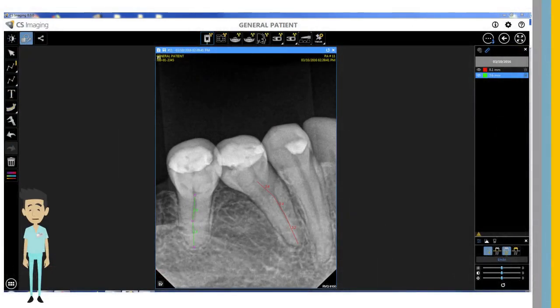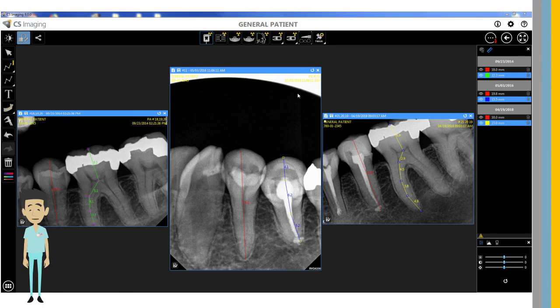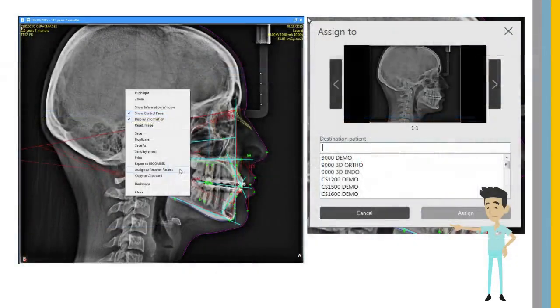CS Imaging Version 8 measurement, drawing, and annotation tools are faster and more intuitive. All tools are utilized directly on images. You can select multiple images to compare measurements. There is a redo-undo feature, and comments can be added directly to 2D images and 3D images in the dashboard. Also, it is now easier to reassign images from one patient to another.